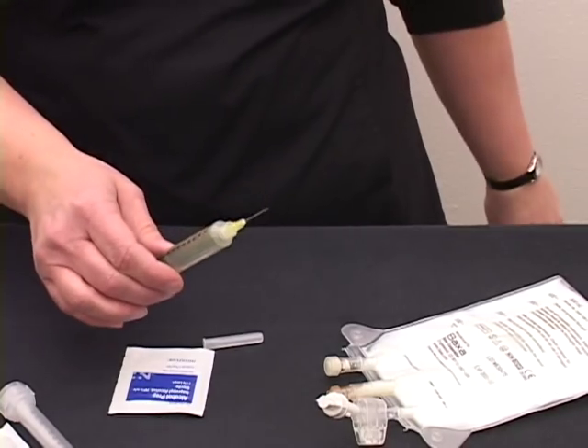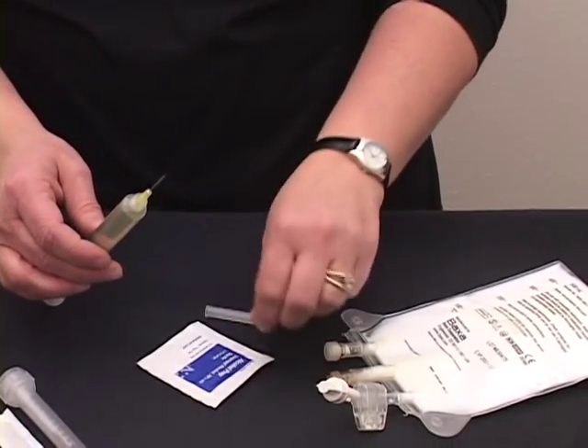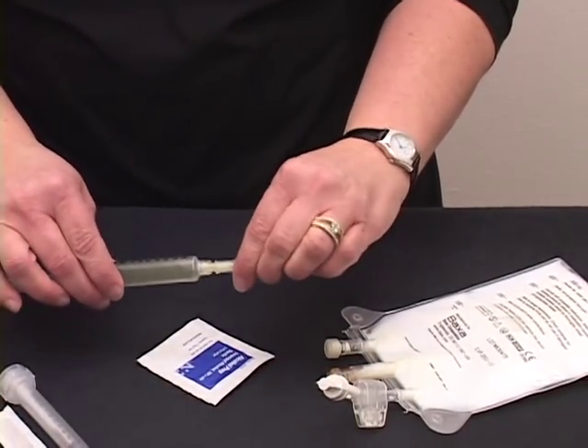Remove the needle, carefully cap your needle and set the syringe to the side.